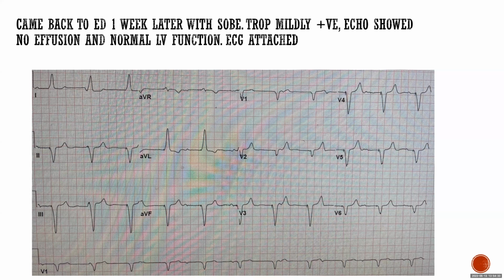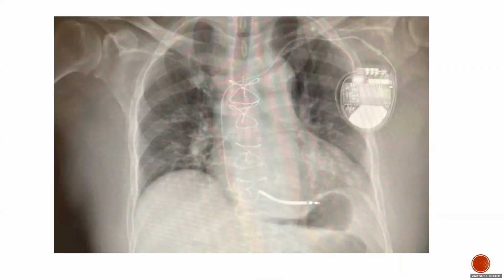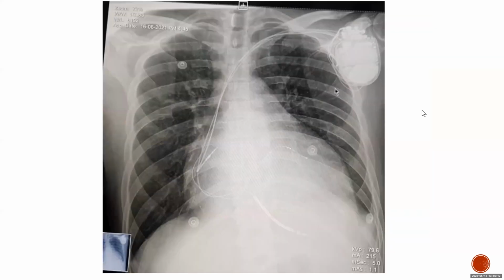Good. Okay, so we'll move on to ICDs. How do you know if the device is an ICD or a pacemaker? By the presence of this coil. Now, the device itself looks different, but this depends on the company and so on. The easiest thing is if you have this coil, which is thick white material on the lead, you know this is an ICD lead. This is an ICD device. So this is how you know from the X-ray if it's an ICD or pacemaker. What's this device?